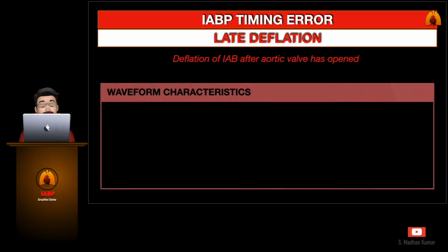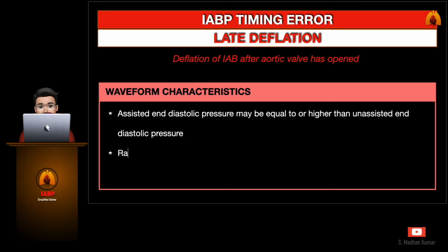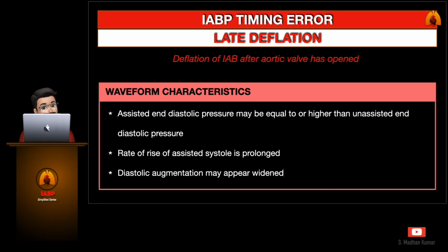The waveform characteristics of late deflation are assisted end diastolic pressure may be equal to or higher than unassisted end diastolic pressure. Rate of rise of assisted systole is prolonged. Diastolic augmentation may appear widened.